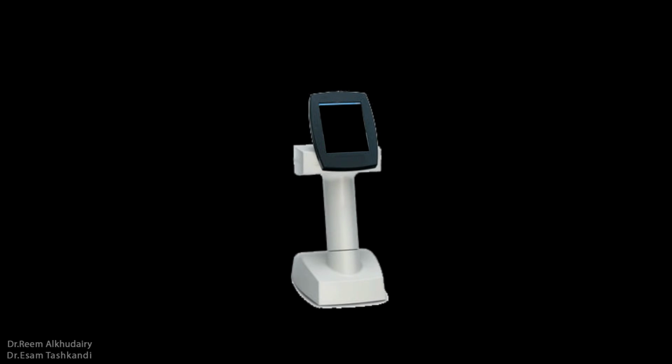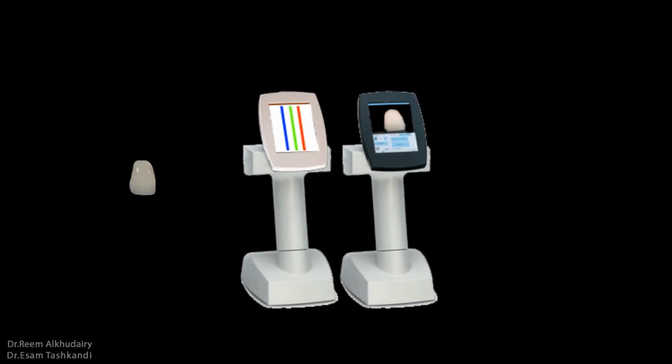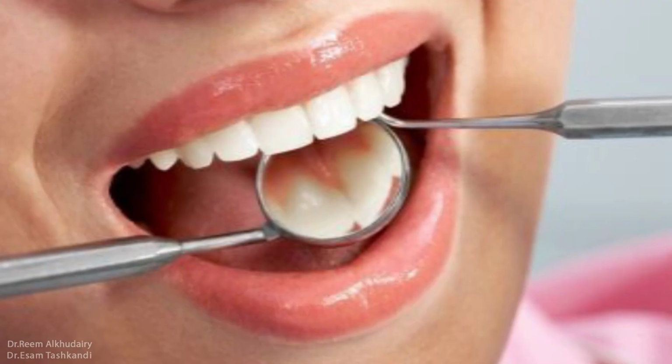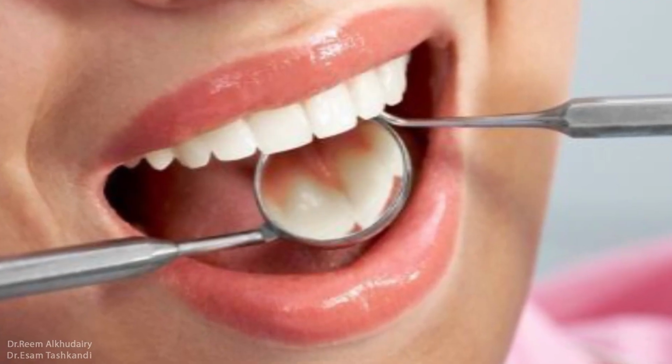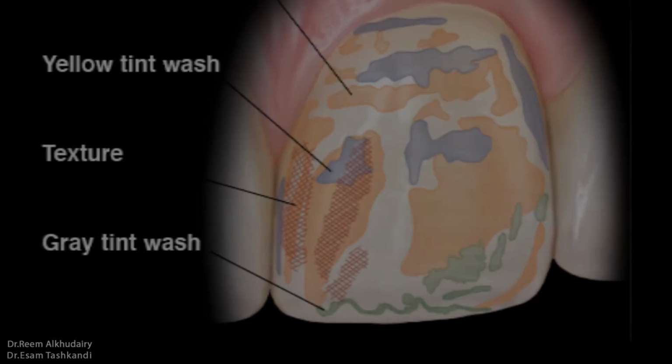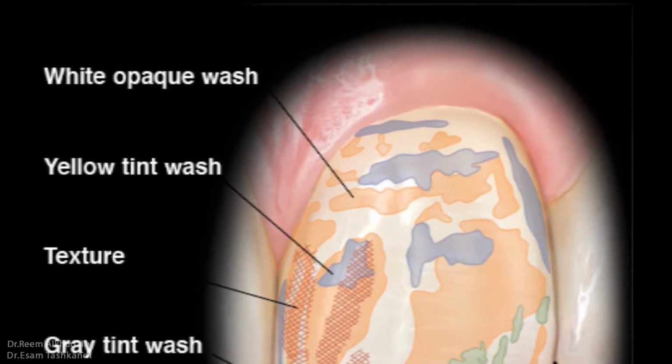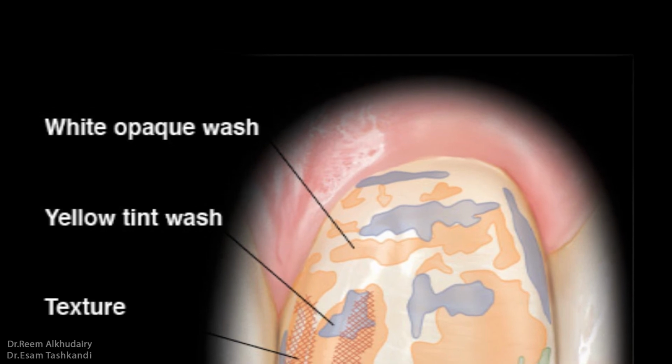Colorimeters provide direct color coordinate specifications, sampling light reflected from an object through 3 color filters that resemble the response of the color receptors in the eye. However, the role of the dental professional is still an important factor affecting the final color match, since no device is currently available that is capable of recording all the fine details and subtle color variations present in human teeth.